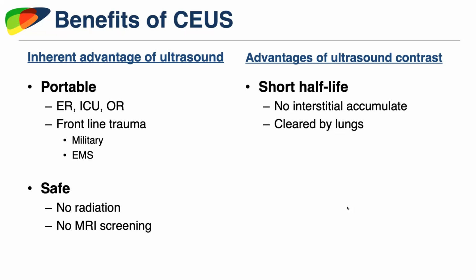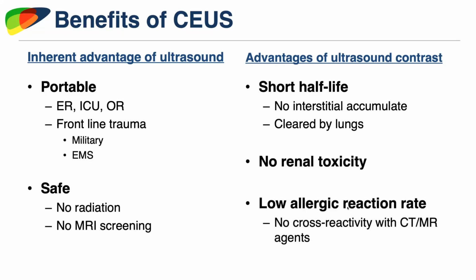And then the advantages of contrast ultrasound agents themselves. We talked about this briefly. The short half-life, cleared by the lungs, not by the kidneys. There's no renal toxicity to worry about. And I know that the worries with renal toxicity and renal clearance with our current gadolinium-based and iodinated agents is less than it once was, but we still have providers and patients who are wary about these other agents. So we have another option for them. And there's an incredibly low allergic reaction rate. There's no cross-reactivity for their contrast agents, and the reaction rate is likely equivalent to or less than that of gadolinium agents today.